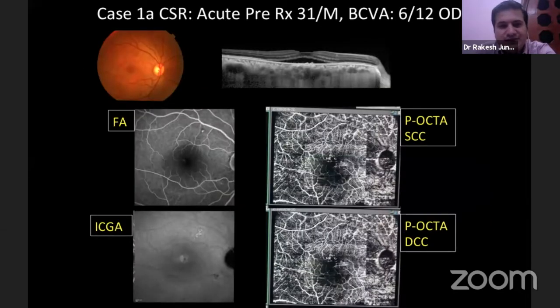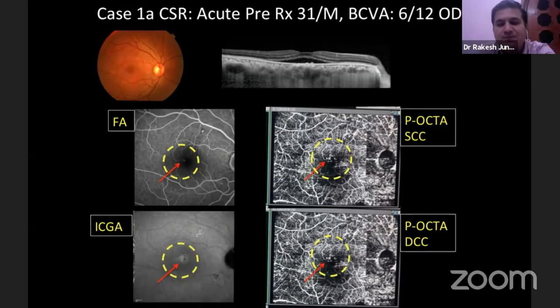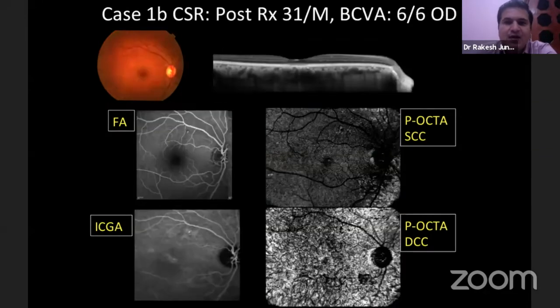Here are a few cases. This was an acute CSR where, on fluorescein and ICG angiography, the area of abnormality is very well documented at the superficial and deep choriocapillary network in the form of tiny dilated bulb-like abnormal choriocapillary pattern at the level of the choriocapillaries on the panoramic OCT angiography.